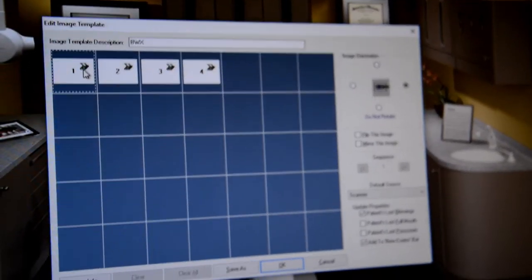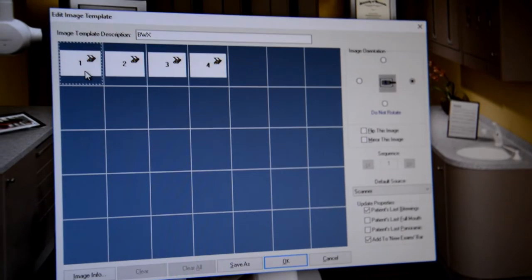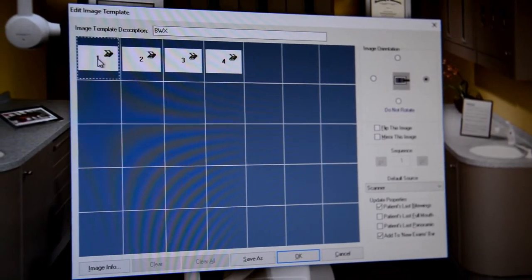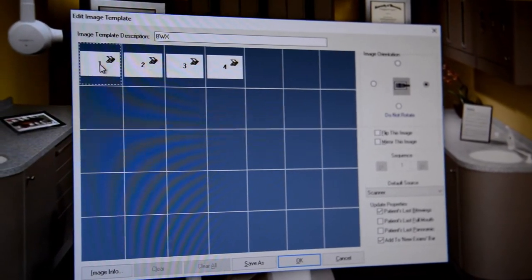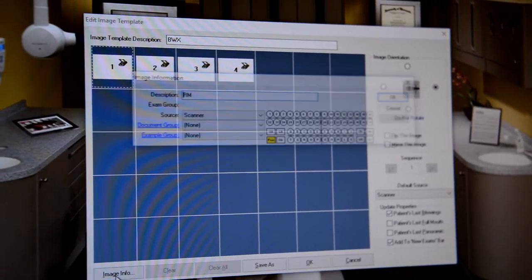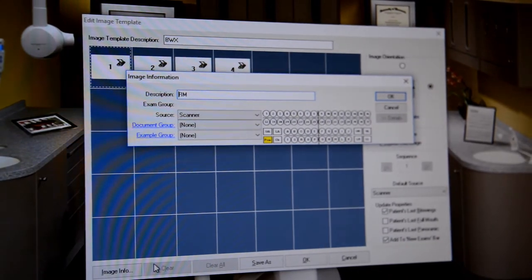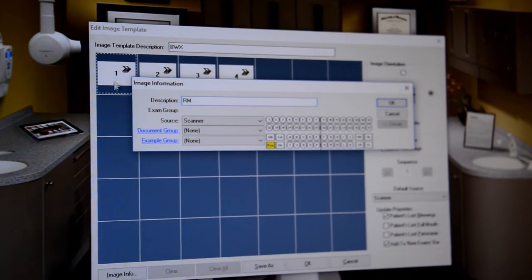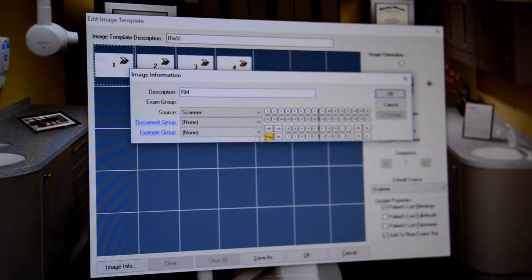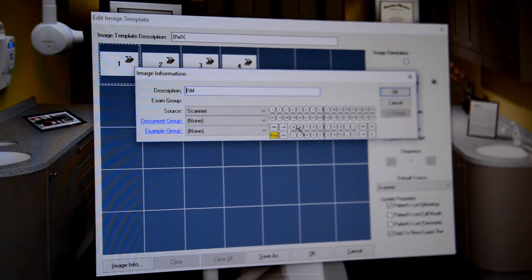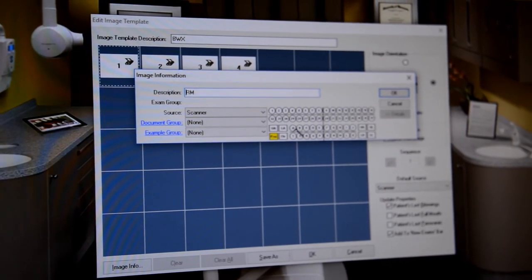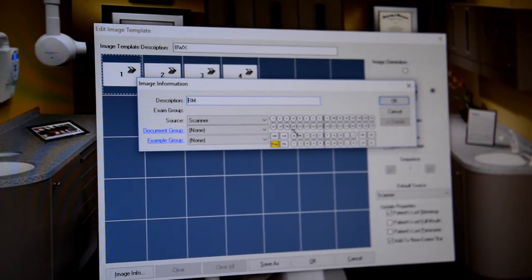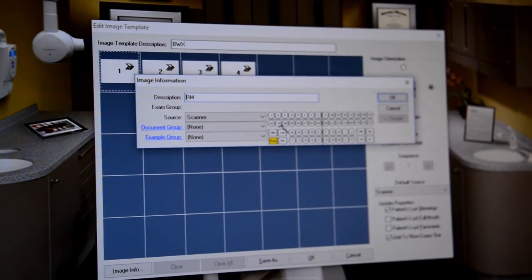And the most important thing when you're setting up a template in EagleSoft. When you click on the image info for that particular area or that particular tile. You want to make sure and label the teeth that you're going to be selecting.